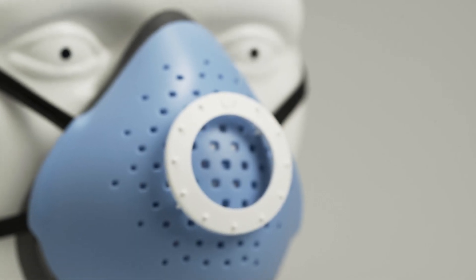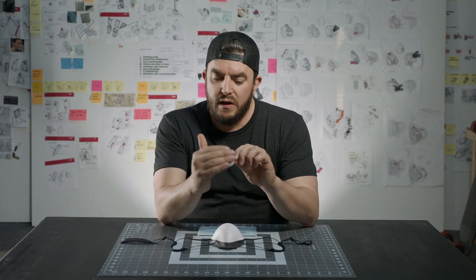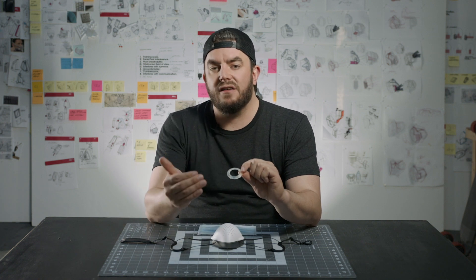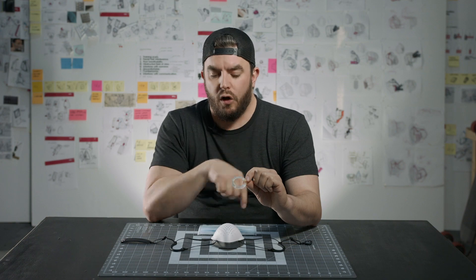What we did was we created this little clip system that has spikes on it to be able to grip a procedural mask. It also provides a standoff so that the procedural mask you can wear over top doesn't clog the holes or the perforation pattern in the mask.